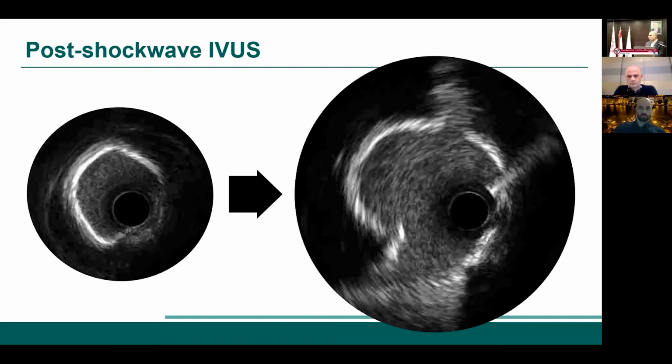We have the guideliner, have good support, the wire is distal, but this combination of tortuosity, this chunk that is there, the morphologies. I know you mentioned a bit earlier trying to modify the angle, but we couldn't. We tried and we thought we needed to do more. So maybe here, for sure, what we ended up doing is maybe take some ideas. We did shockwave, we cracked the calcium, it's an unfavorable angle. What do you think, Ali, first, what to do then?